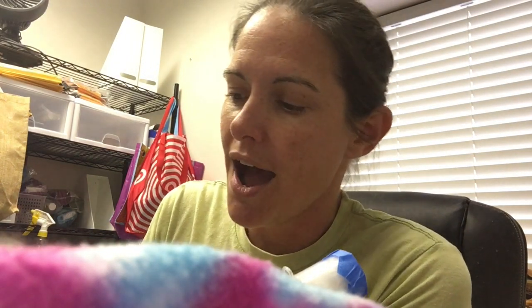Hi, it's Cassandra here, the Neonatal Director with Maddie's University and American Pets Alive. I am here to show you how to tube feed a kitten. We got in this family, a mom with babies, and they came in to us with upper respiratory infection. You can see this little guy is mouth breathing a little bit, and you can hear him snuffly. He's having trouble nursing from mom, so he's been losing weight. So what we're going to do is go ahead and tube feed this baby.